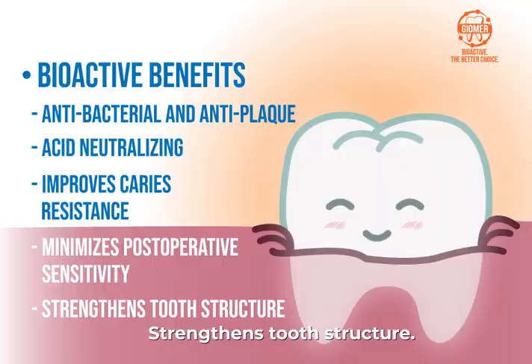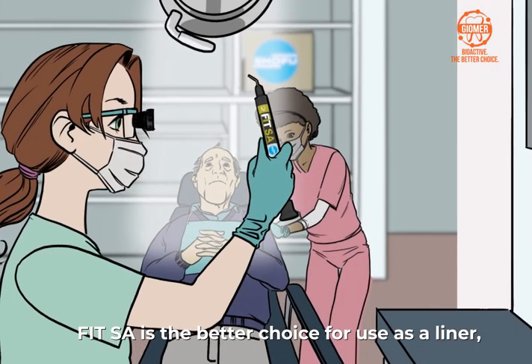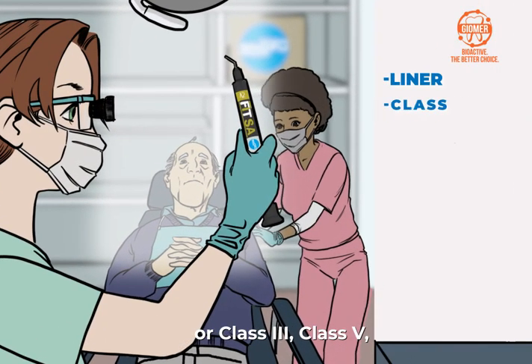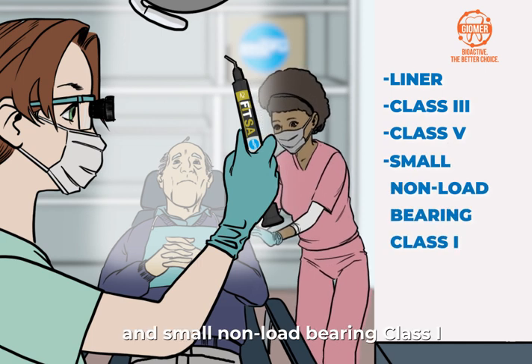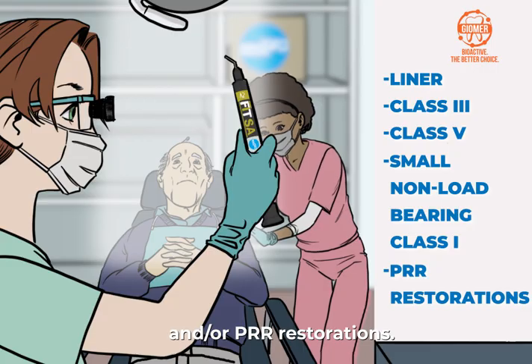FIT-SA strengthens tooth structure and is the better choice for use as a liner, or class 3, class 5, and small non-load-bearing class 1, and/or PRR restorations.